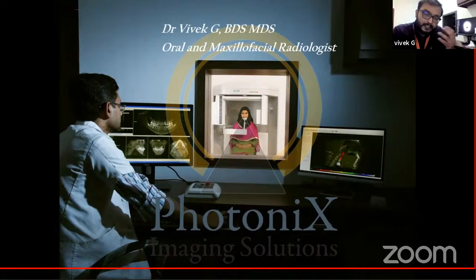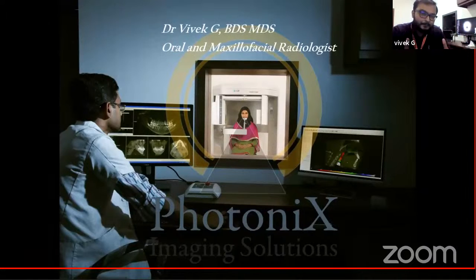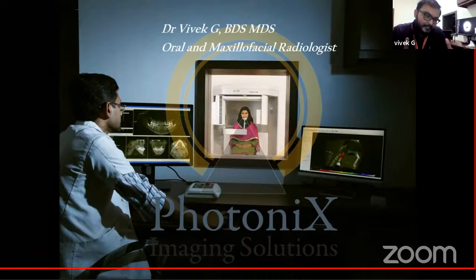Basically, I was talking about dental imaging modalities earlier, and I was telling you that the bread and butter intraoral periapical radiographs and all those two-dimensional radiographs are very much essential for our day-to-day practice. But sometimes, just sometimes, they might not tell you the whole story. I'll explain with this particular figure. On one side there is a panoramic sectional radiograph, and on the other side, as Dr. Binu sir was telling, 3D is always fun. So I was going with fun, and this is our Super Mario. He's going to save our princess.